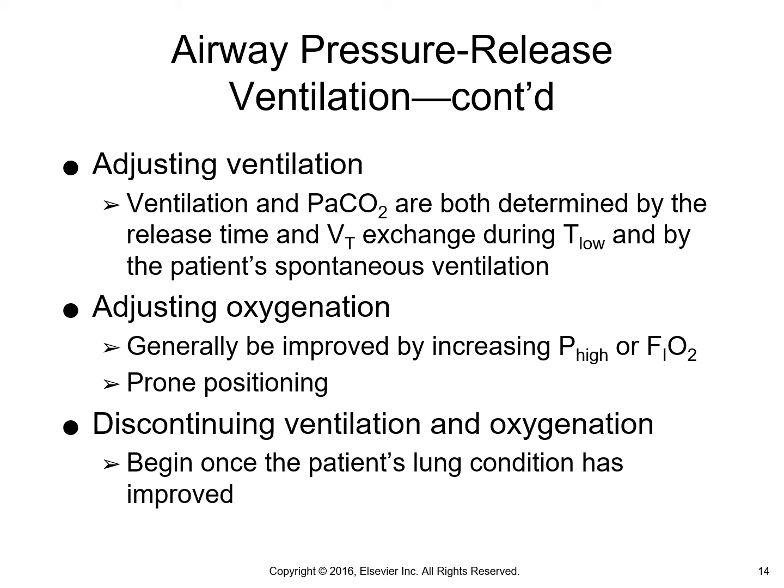All right, how do we adjust the ventilation or oxygenation? If we have to make changes on these vents, what do we do? The ventilation and our CO2 are determined by the release time and the tidal volume exchange during that T low. And patient spontaneous ventilation is huge.